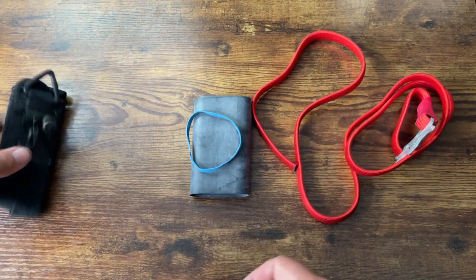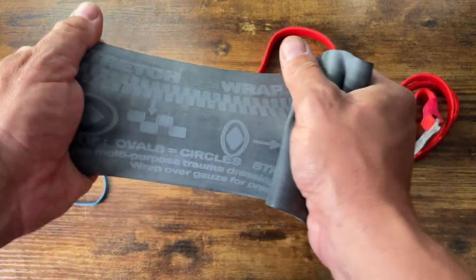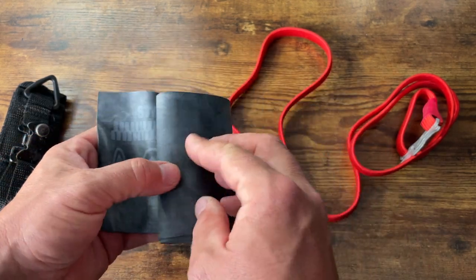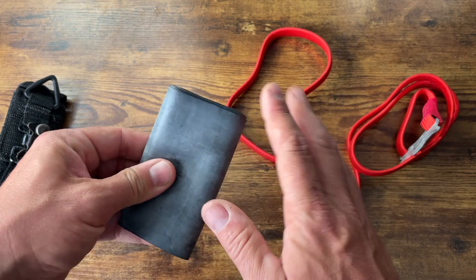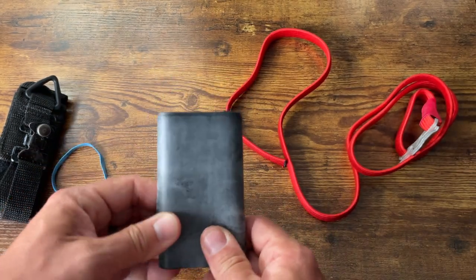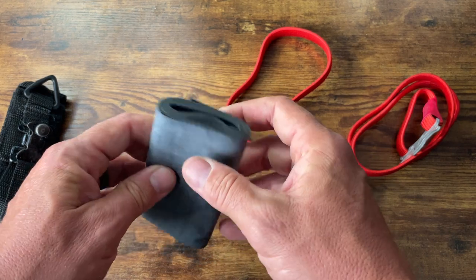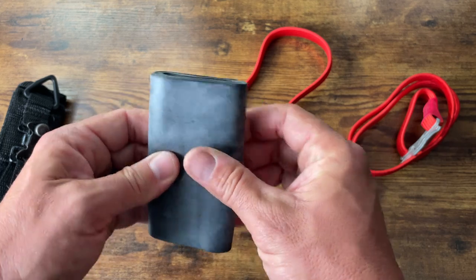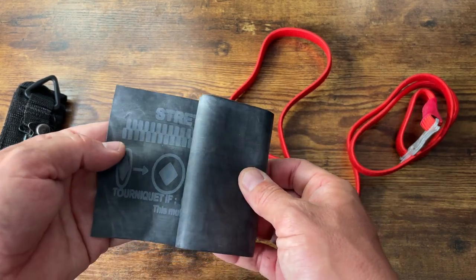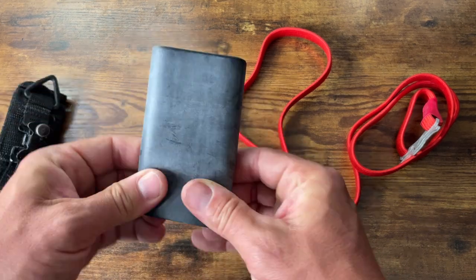Next is the SWAT tourniquet, which is basically a big elastic rubber band. It does not work very well as a tourniquet. It does however work well as a pressure bandage - if you had a piece of cloth or something underneath that you could wrap tight, it works in that capacity. But it's not the best as a tourniquet - it just doesn't apply enough pressure. Some people like to use these for kids and dogs because their limbs are smaller, but I still do not recommend the SWAT as an actual tourniquet. You just can't get them tight enough.